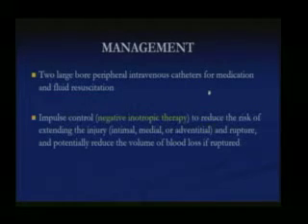Sure. Would you use MRI for evaluation of endoleaks for growing aneurysmal sacs? Does that help you? Definitely. CT with contrast is extremely helpful in case you're evaluating for endoleak. But if the patient has chronic kidney disease, creatinine is elevated, then usually we go with the MRA. If the sac is increased in size, we might not be able to localize where exactly the endoleak is coming from.